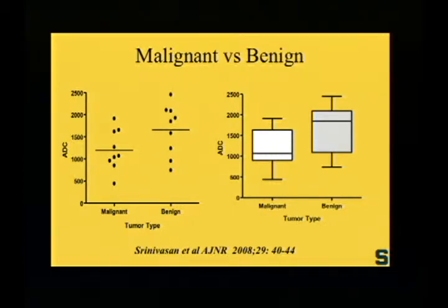So with me being a clinical radiologist on some of these indeterminate masses that we see, we routinely perform MR diffusion because it has helped me on numerous instances trying to distinguish between a benign and a malignant lesion, especially on ones that have a lot of imaging overlap between those two.